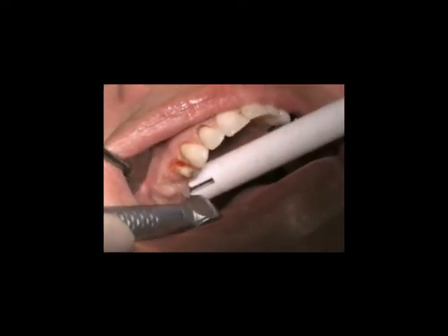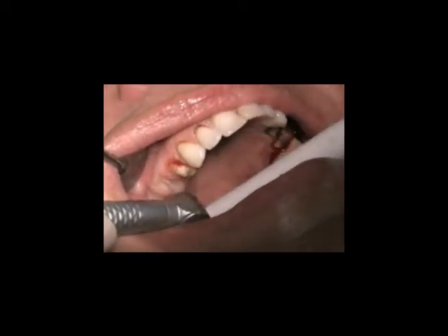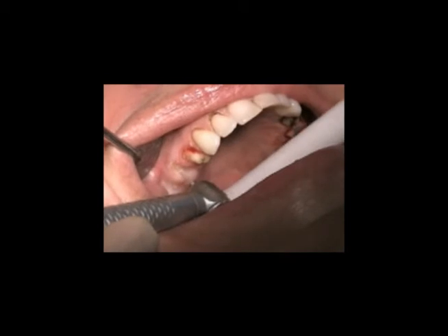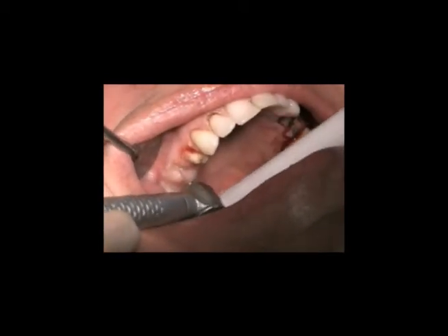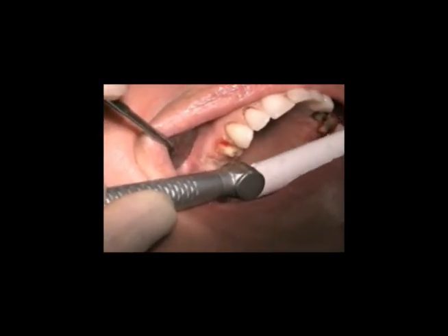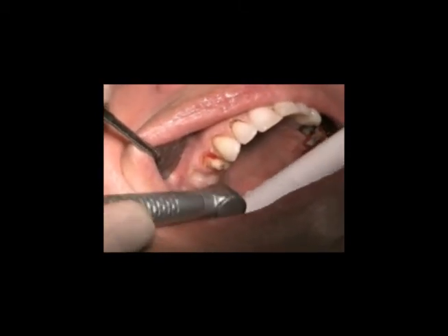We're creating the ovate pontics so that the crowns — the final result — will grow out of the tissue. The Erbium Chromium water laser is paramount to finishing these cases to the patient's desired perception. It will give an incredible stunning case. Symmetry is beauty and this creates symmetry.